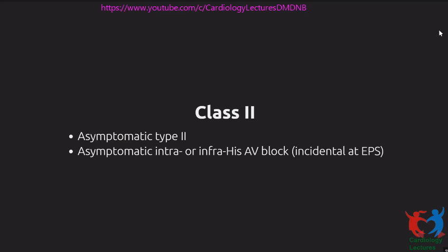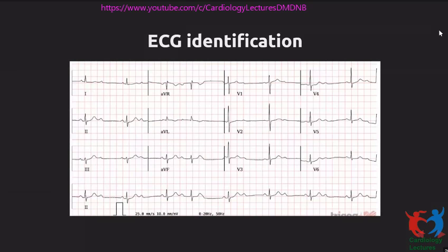If you have asymptomatic second degree AV block, in that case, it becomes important to know whether it is infranodal or nodal. So if you see a type 2 pattern on the ECG, it's considered typically infranodal. Or if you demonstrate on EPS that it's intra or infrahisian block, then you need to pace these patients. So clearly nodal block has a more benign prognosis, can be physiological or functional, whereas infranodal block typically indicates pathology and has more malignant outcomes. Therefore, this differentiation. Now, how do you identify this on the ECG?